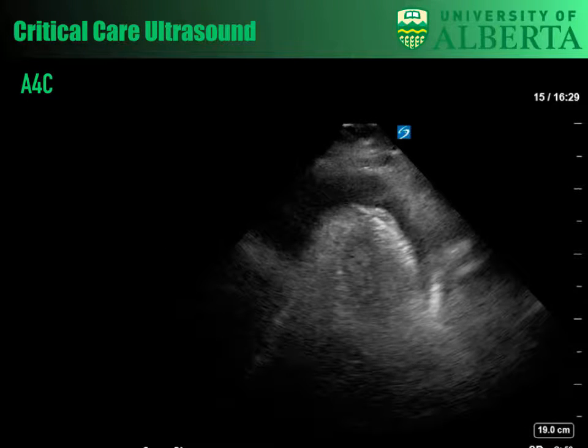Brian, can you give some advice on how quickly this scan should be done? Because that's the patient in extremis. You see something horrible, you're pretty sure it's tamponade. How do you count it out at that point? I don't mean that in a flippant way. I've seen a lot of bedside ultrasounds where they're very helpful for the first couple of seconds, and then not very helpful because the person's in the way of the resuscitation that's going on. It's kind of like diminishing returns as time goes on, right? And that's how you look at the clinical situation.